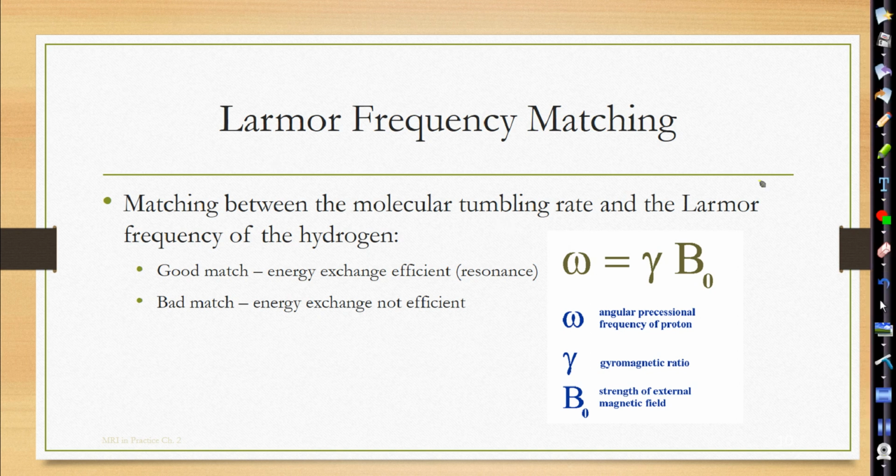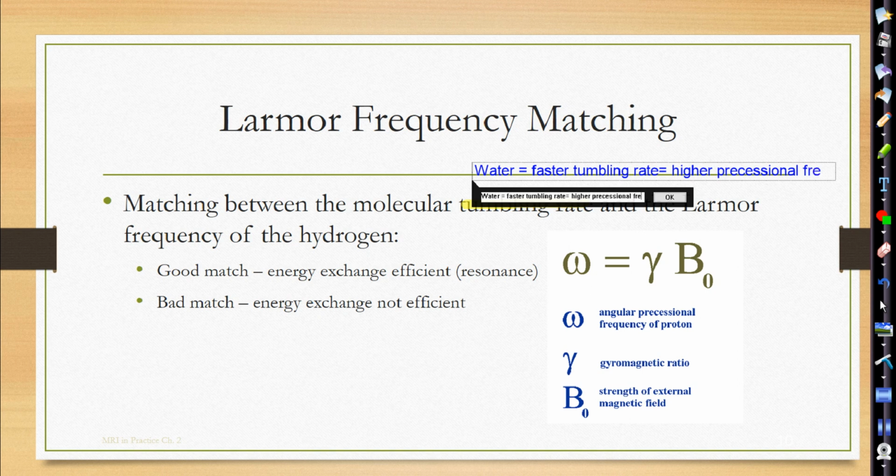So, good question. Tumbling rate. So I would put down here water. Faster tumbling rate, which equals a higher precessional frequency.